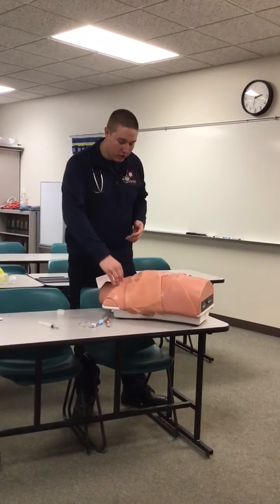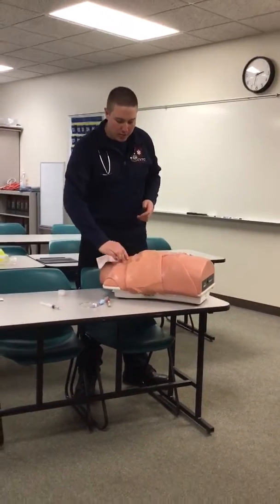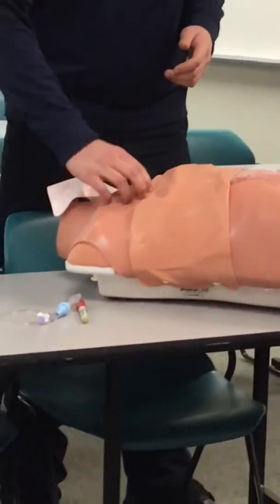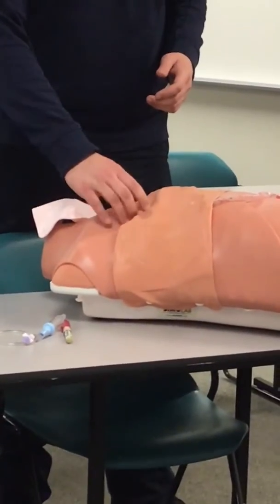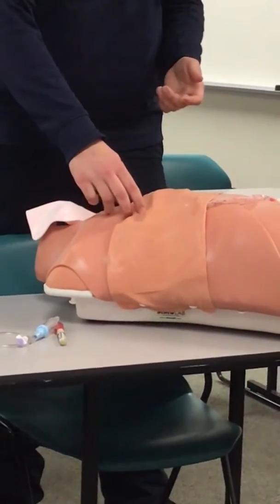You have the clavicle here, your first rib falls into that clavicle. So you got your first intercostal space, second rib, second intercostal space, third rib, and then third intercostal space. You can go either second or third intercostal space. I'm gonna go second intercostal space.